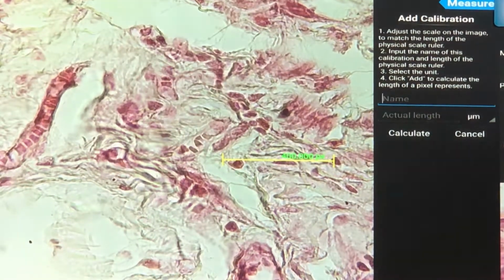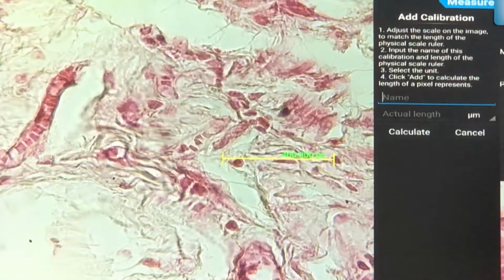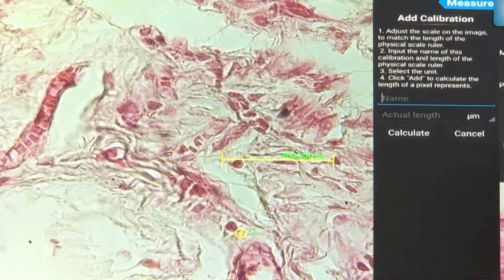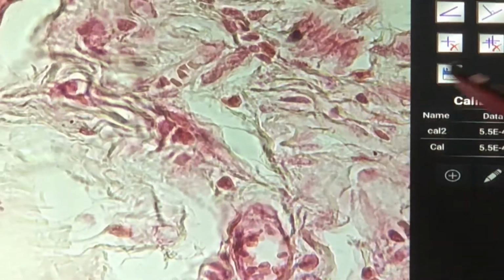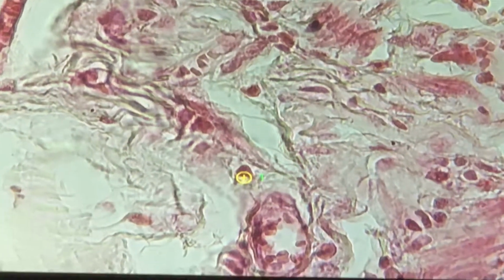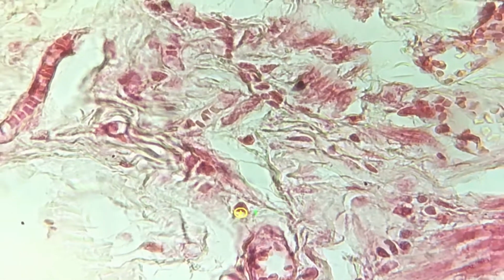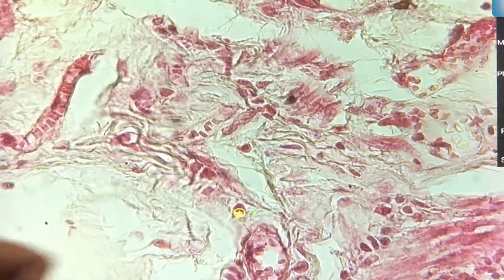I will point to you the eosinophil, which is in high power objective. This one. That's an eosinophil. Eosinophil, not so nice looking because it is already compressed through the fibrous tissue. That's eosinophil. It is very big.